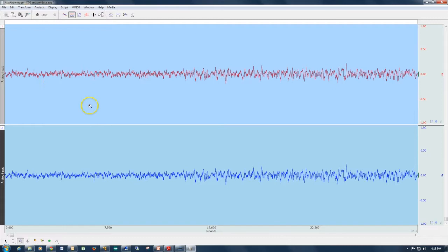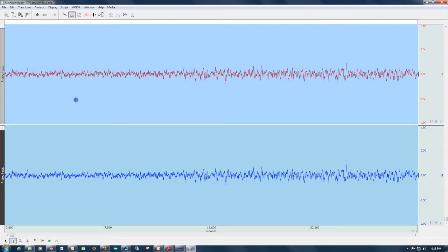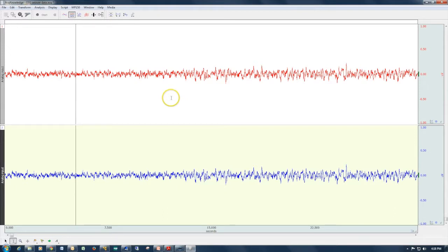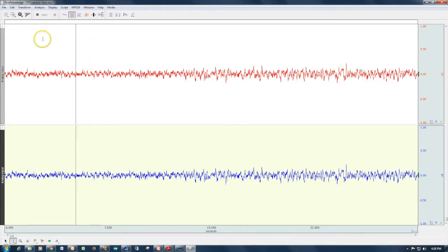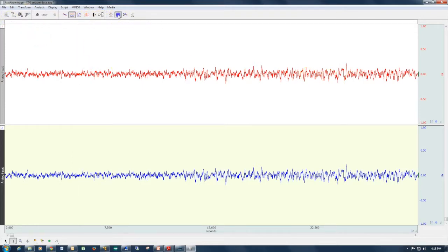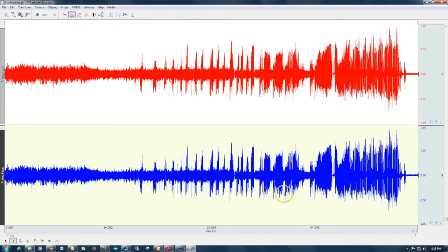Here we have an EEG file recorded from a rat using a telemetry system. This is looking at about 30 seconds of data. If we compress everything down, we can now see approximately one hour of data. The two channels are identical.